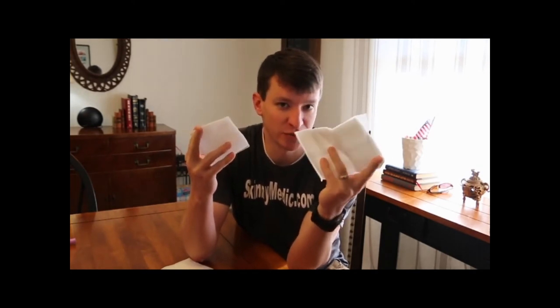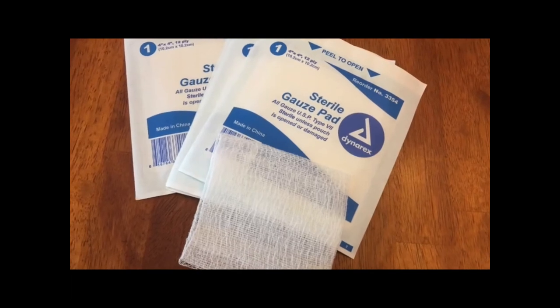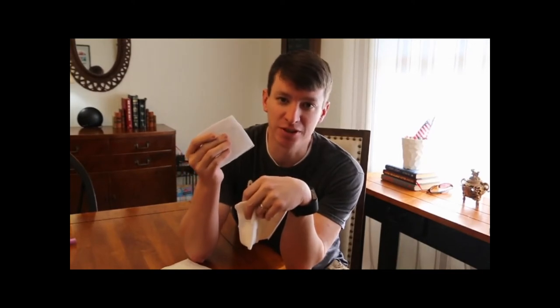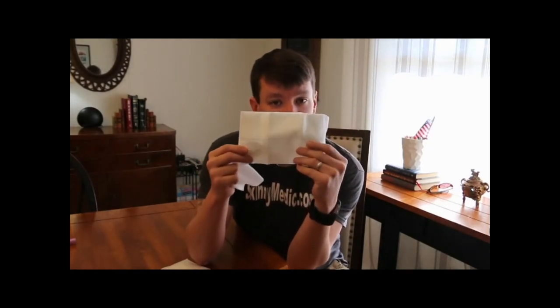Right, so when we talk about bandaging wounds, we can pretty much all agree on 4x4s and 5x9s. They're the two most prevalent types of gauze we use for that. This is what you're gonna see on every ambulance, most first aid kits, things like that. The 4x4 here is for minor injuries, okay, minor wounds. This is gonna be oozing blood, abrasions, things like that. It really doesn't absorb that much blood. Then you get to the 5x9s. This is more for moderate to heavy bleeding, so this will absorb a lot more blood.